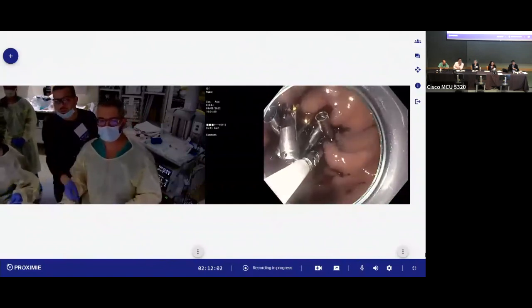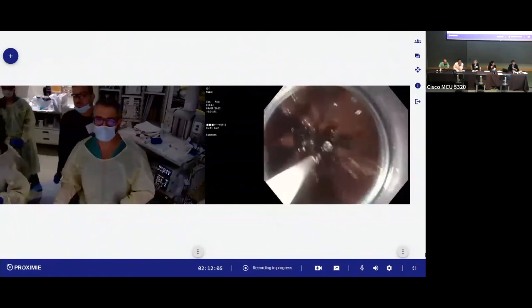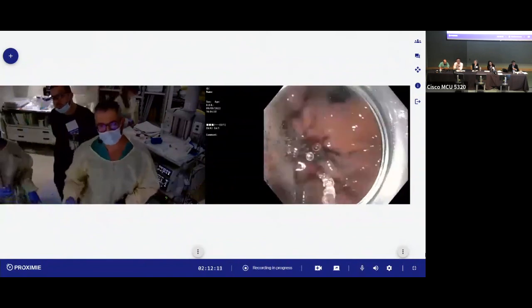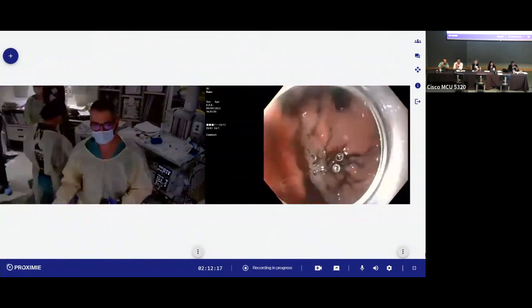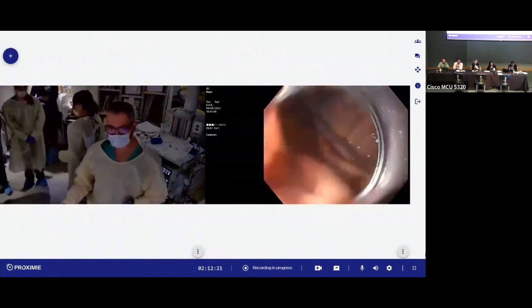Close. Nice, deployed it. It's okay, you did a great job. All right, I think that's enough. I'm not going to close more than that. Looks great. Mohammed, fantastic job. Congratulations to you and the entire team in the room. Thanks. We're now going to move to just one color forward.